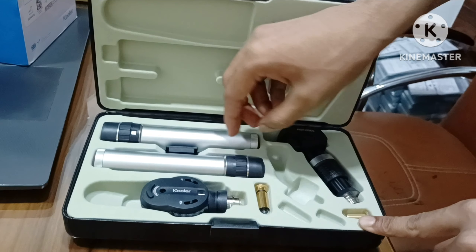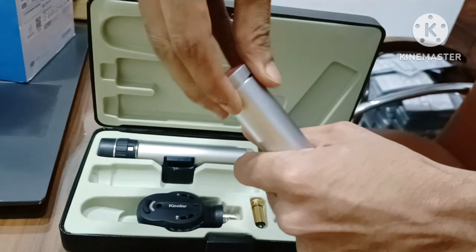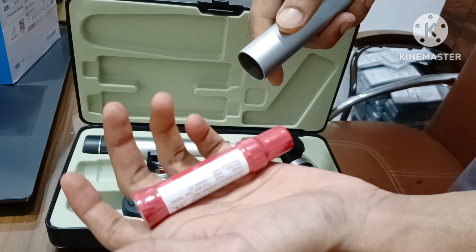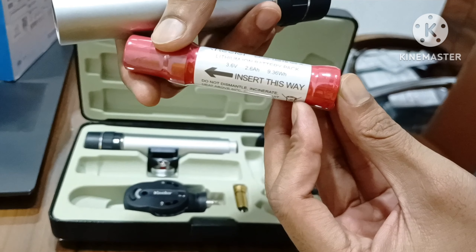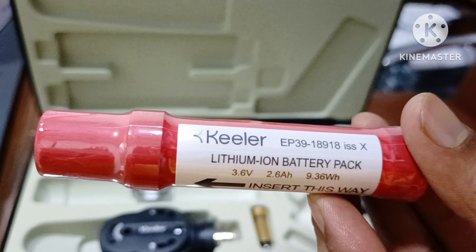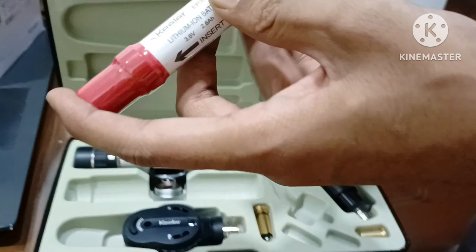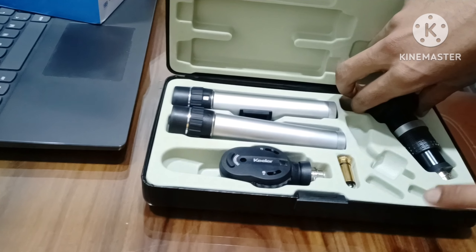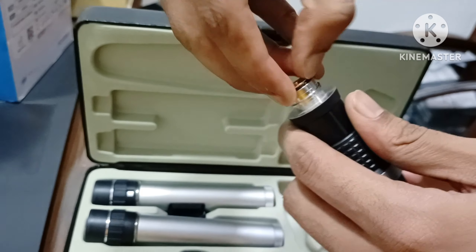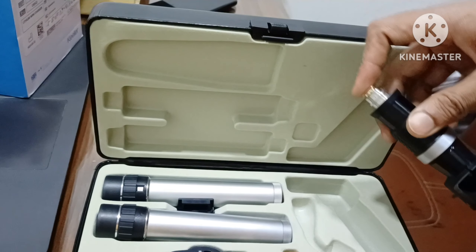One extra bulb, with two handle rechargeable with lithium batteries. One bulb infix and one bulb extra.